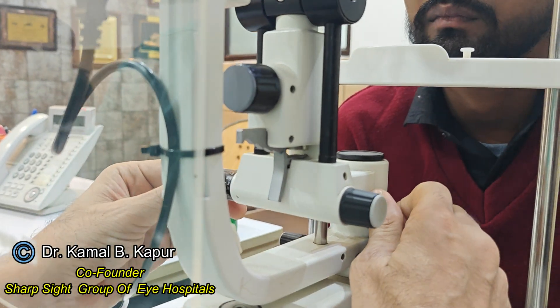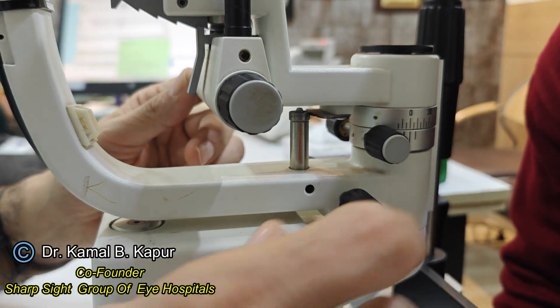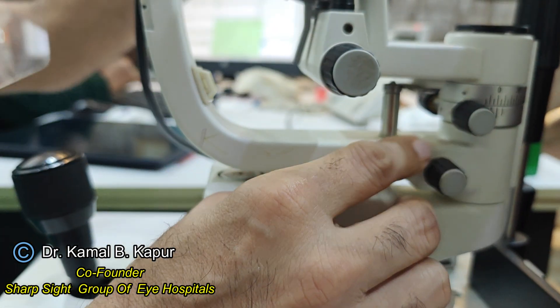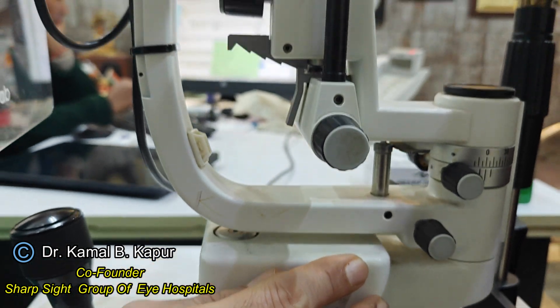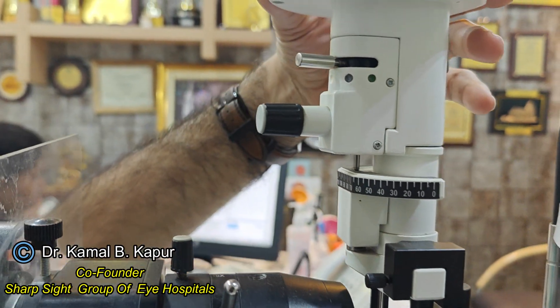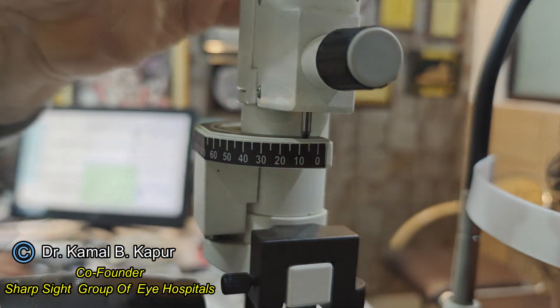To mark the corneal axis, we first line the two arms of the slit lamp straight in one line till they lock in the center. Once they fix, we lock them and then move the slit lamp axis to 0-180. We also ensure the thinnest possible slit and the beam at 0-180.